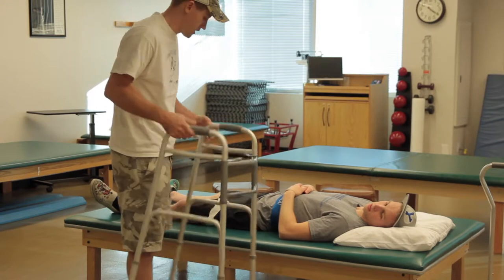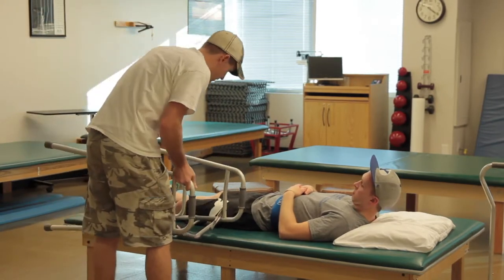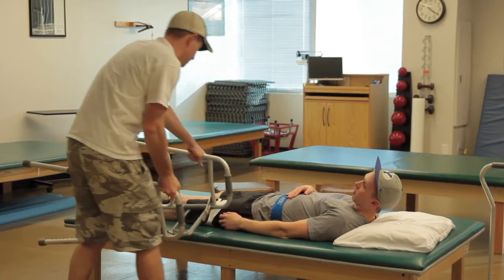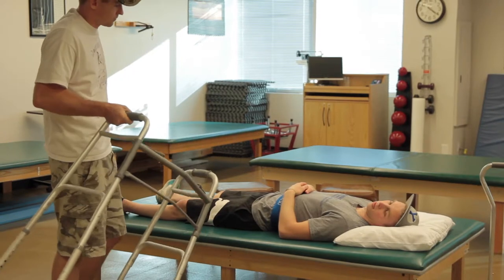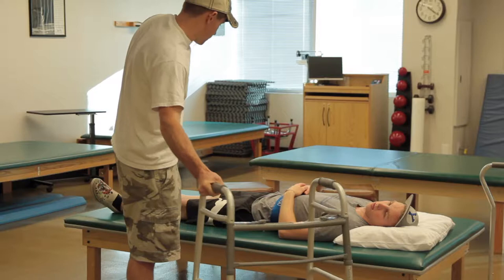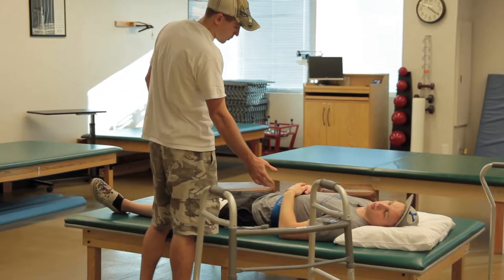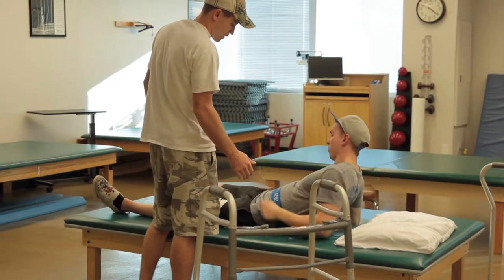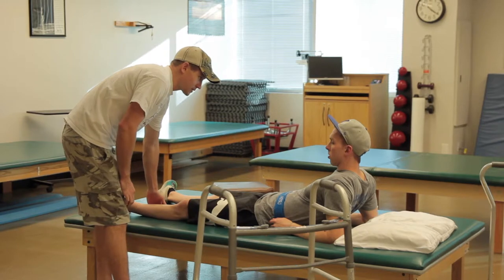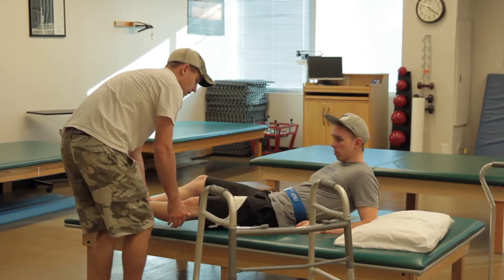Okay, so walker, let me go ahead and make sure it's the right size for you real quick. Go ahead and put that wrist down for me. That is perfect. We want it right at the break of the wrist, or right at that hip joint right there. So what we've got to do first is go ahead and sit up. What I need you to do is come up onto your elbows for me. We've got your gait belt on, your shoes ready to go. I'm going to support this leg, and you're going to pivot your body up to the edge for me. We're going to come right to the edge.